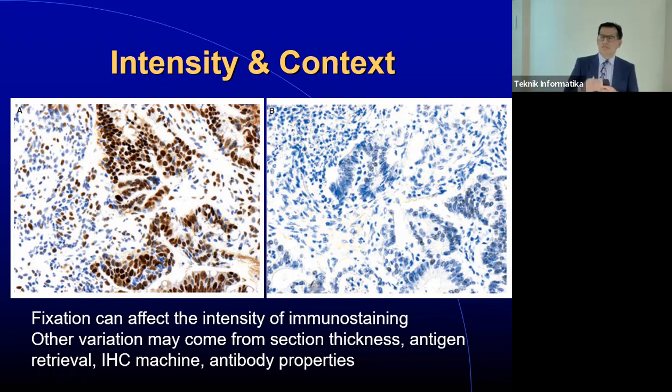So immunostaining may be one of the biomarkers we're using to evaluate the tissue. And so the biomarker itself can be confounded by what's happened upstream in terms of the processing of the tissue.